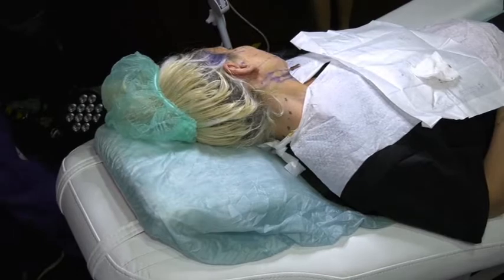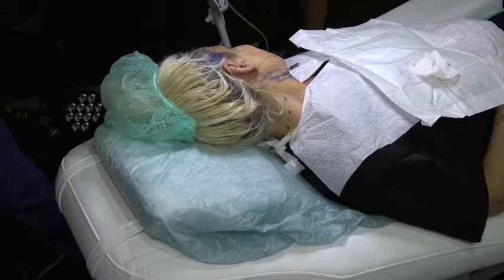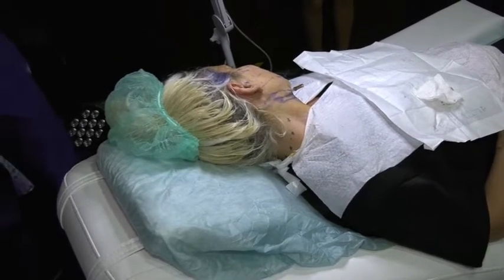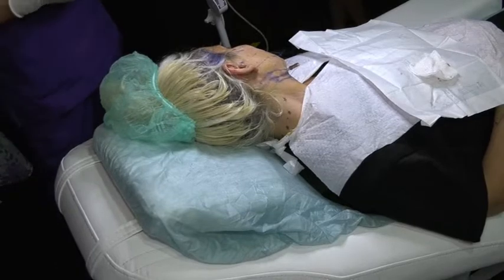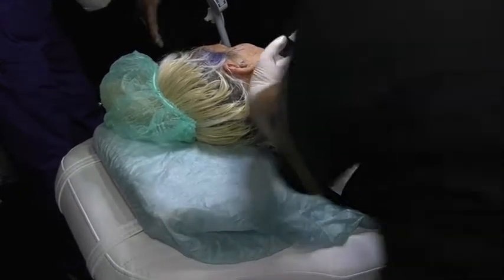I know it's not easy to pass the first one, but try to be slow. If you manage any difficulty, withdraw your cannula back, change a little bit, and go. Slowly. Milli by milli, no problem. You are knocking the door. They will open for sure. Keep going. Lift the skin and go out.